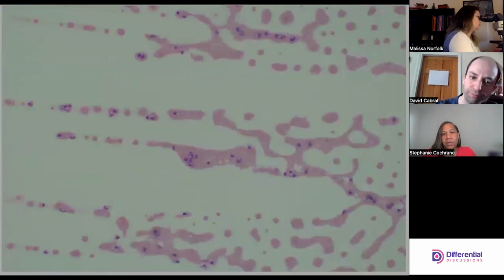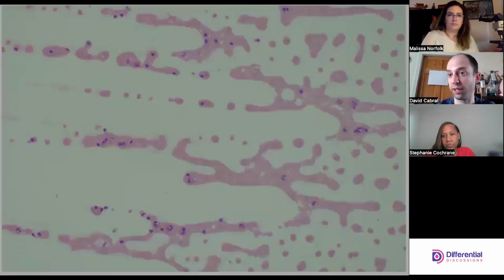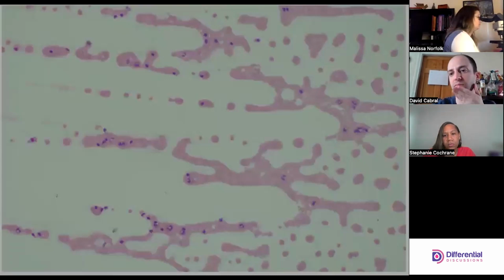Usually, I mean, babies are prone to having platelet clumps due to the collection of the sample, but usually you do see those more towards the feathered edge. I don't really see any platelet clumps. So I'm glad that you brought that up. So we could account for a 77 platelet with maybe platelet clumps, right? That could explain why the analyzer had a low count, but we're not really seeing that. No. Yeah, maybe we can go into the body and then go up in magnification.